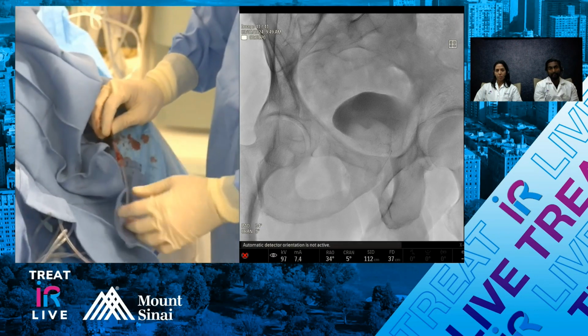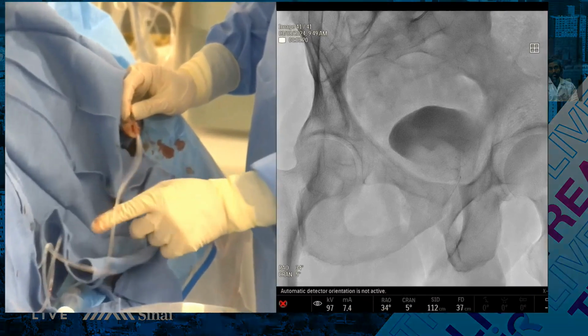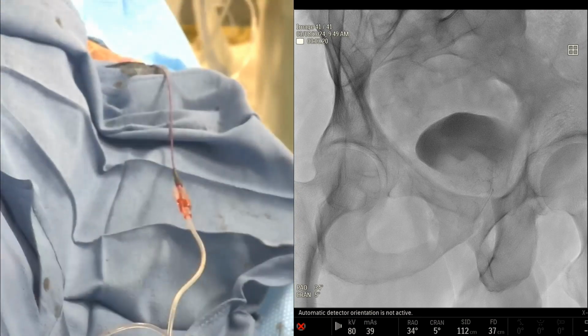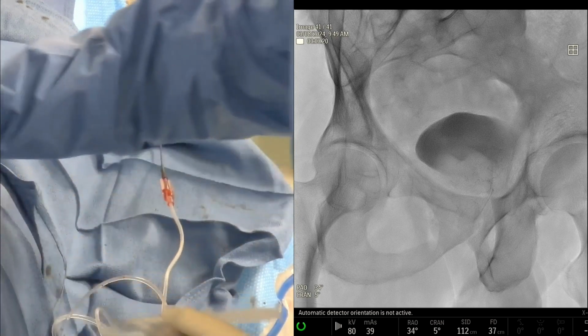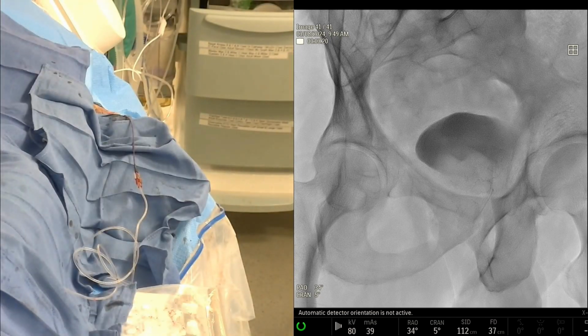Well, that's a great question because we don't need to with glue. And you saw what we did on that last bit of glue. We put almost like a little plug at the top after we got that distal. So I try to occlude the parent vessel just with the liquid, so you don't need coils. You can use them, but there's no need because you have so much embolic here that you can use to form a plug. So no, the answer is no, Jay.